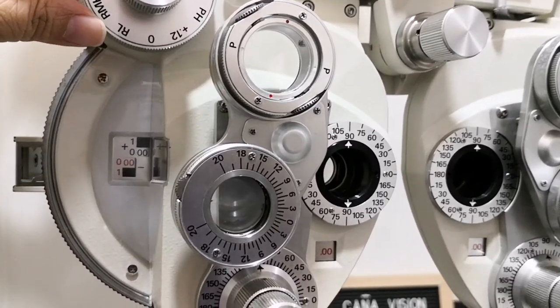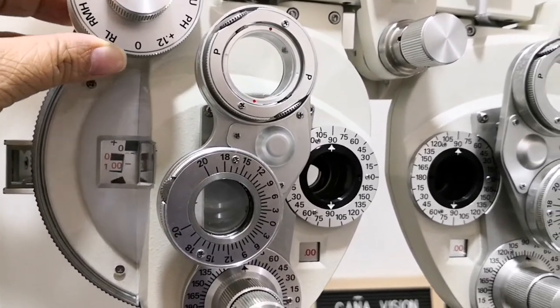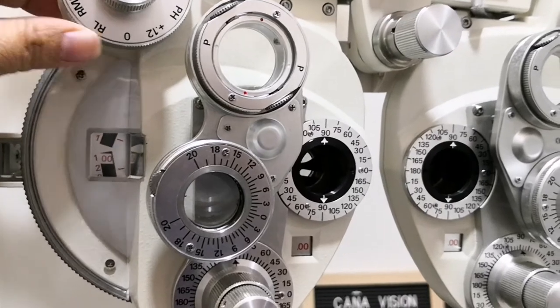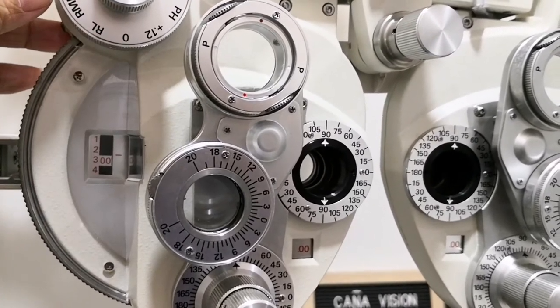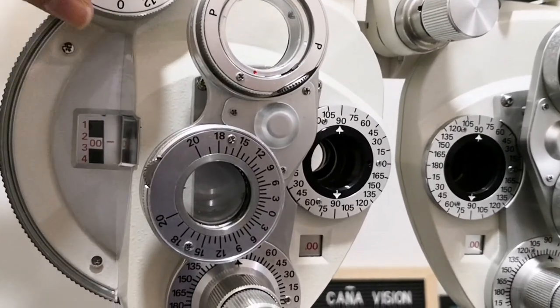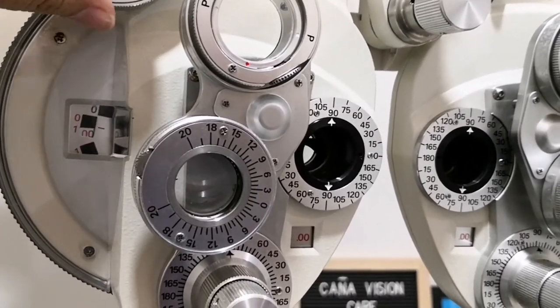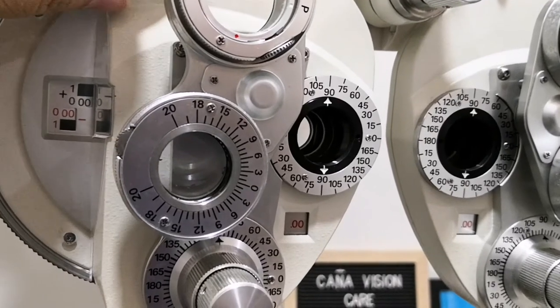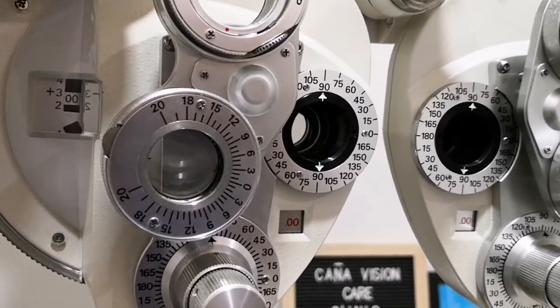And this is the strong spherical control. It differs from different phoroptor brands. For this brand, the increment is by three. The red colored numbers represent the minus lens and the black represents a plus lens.